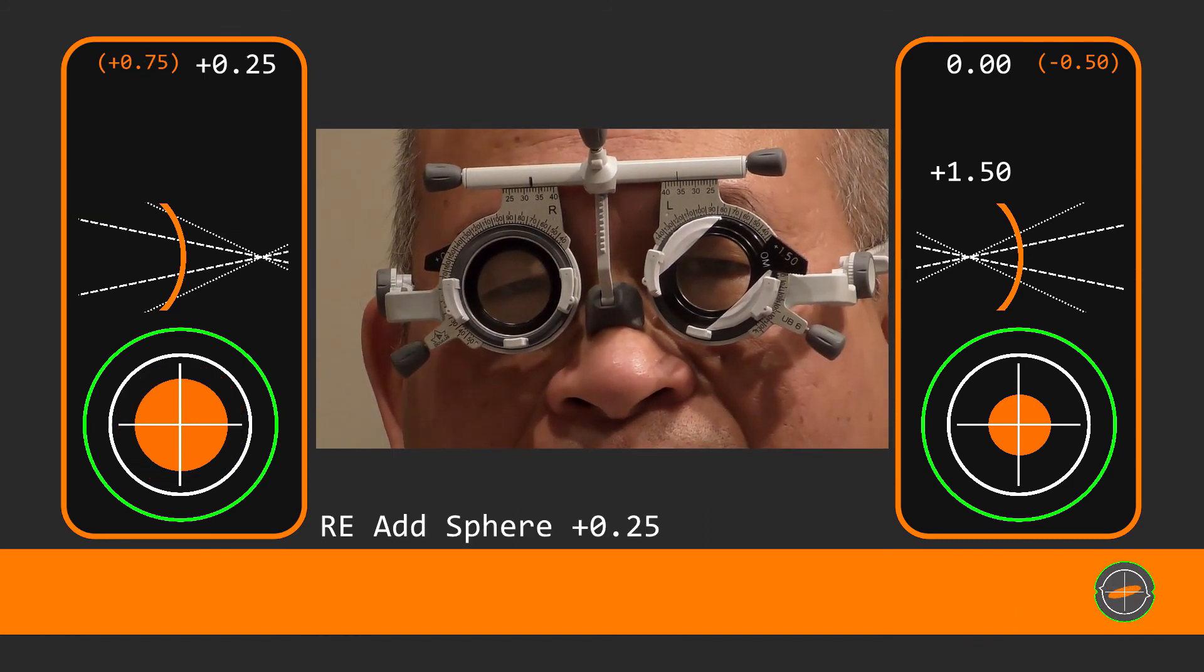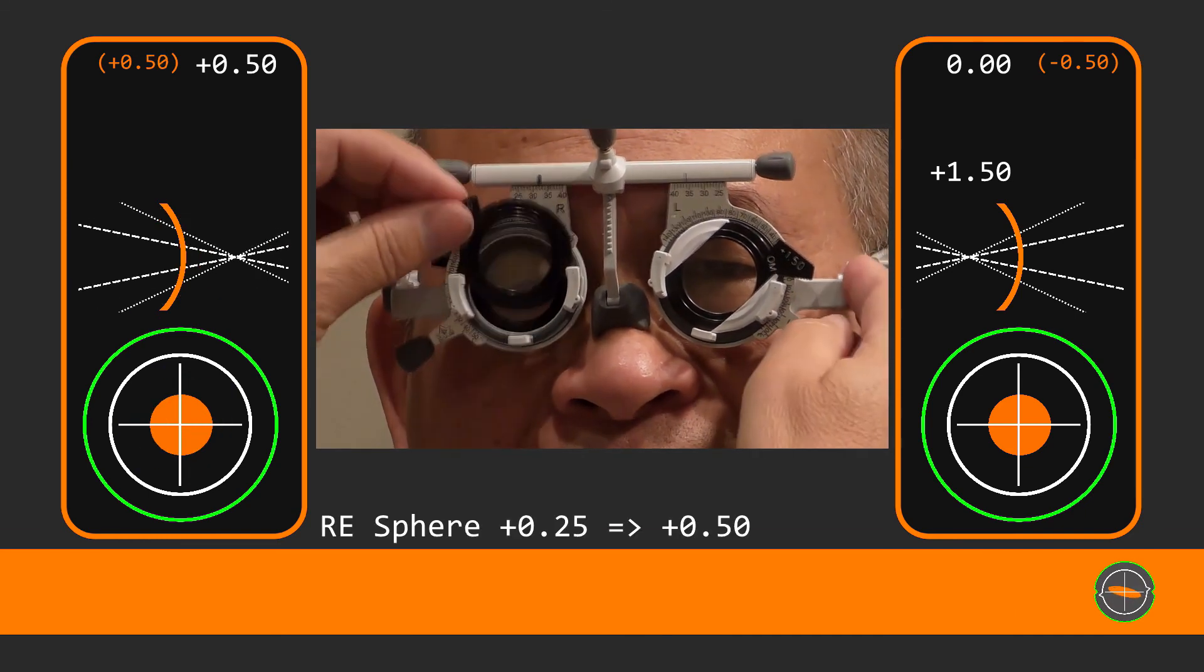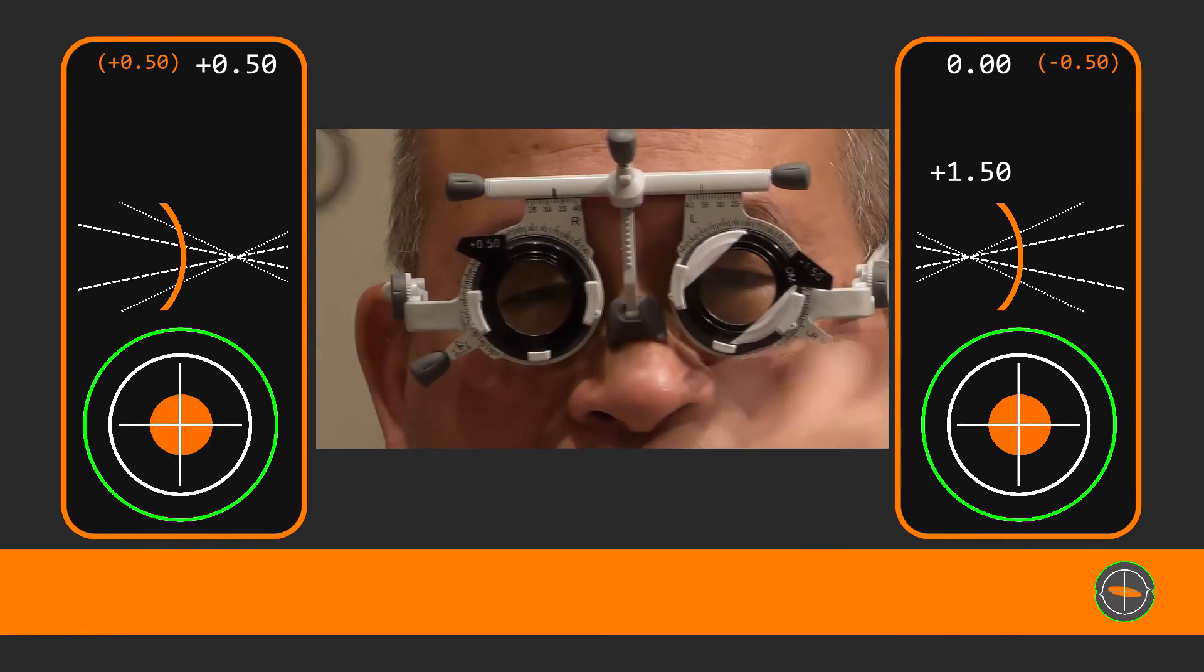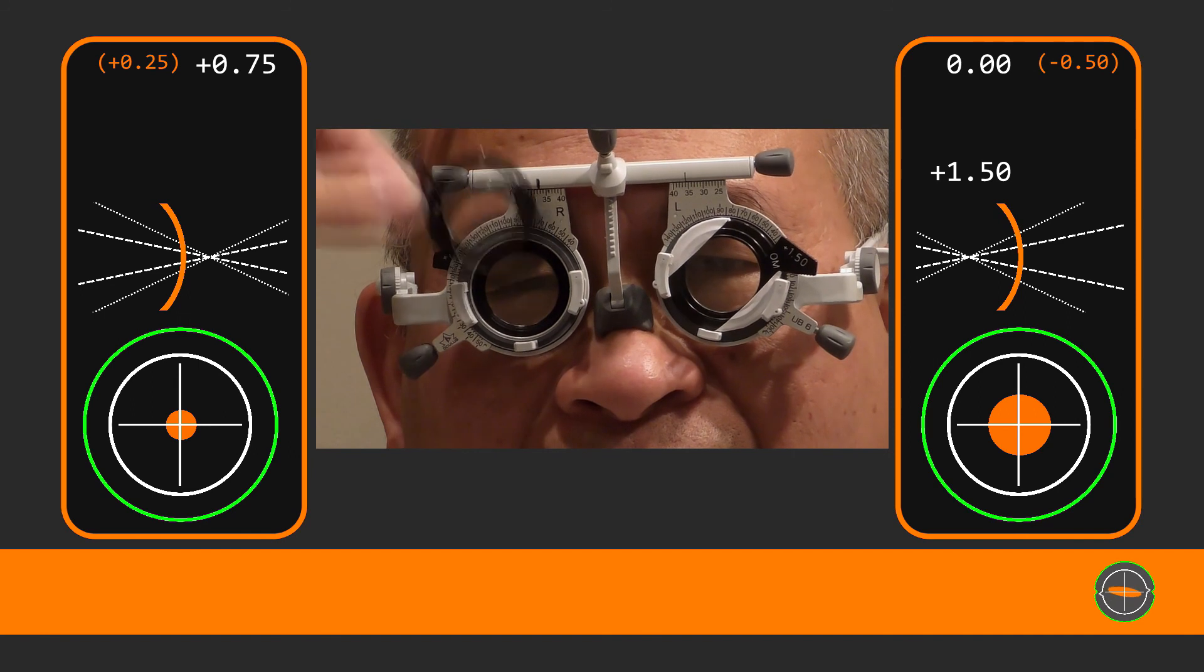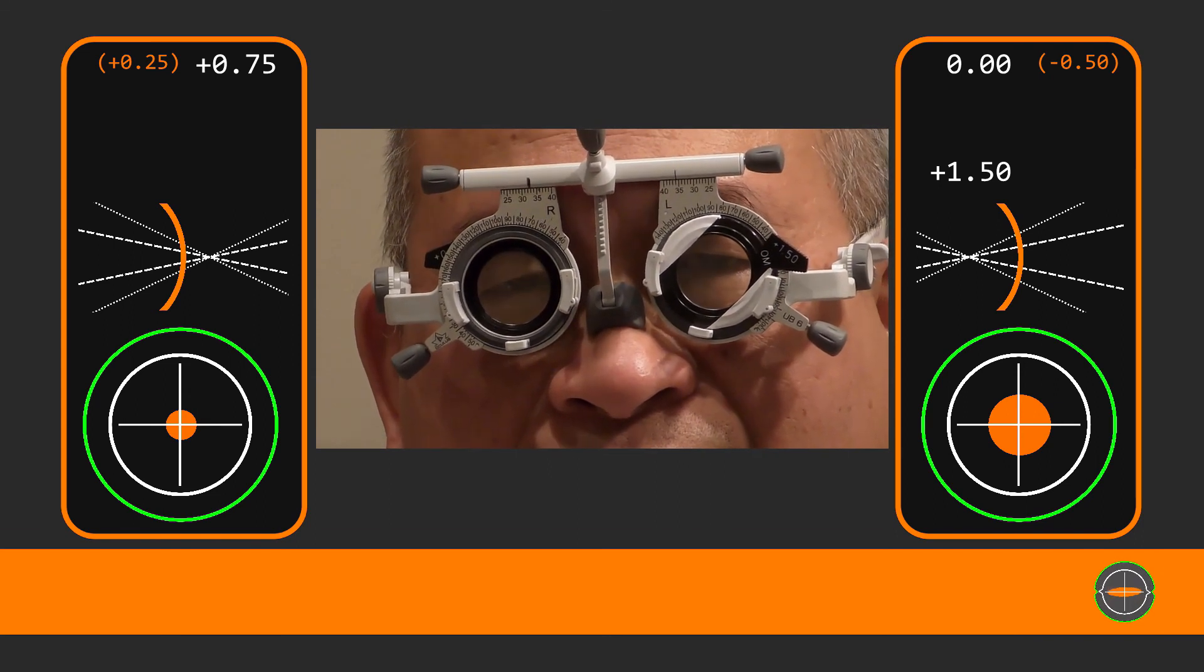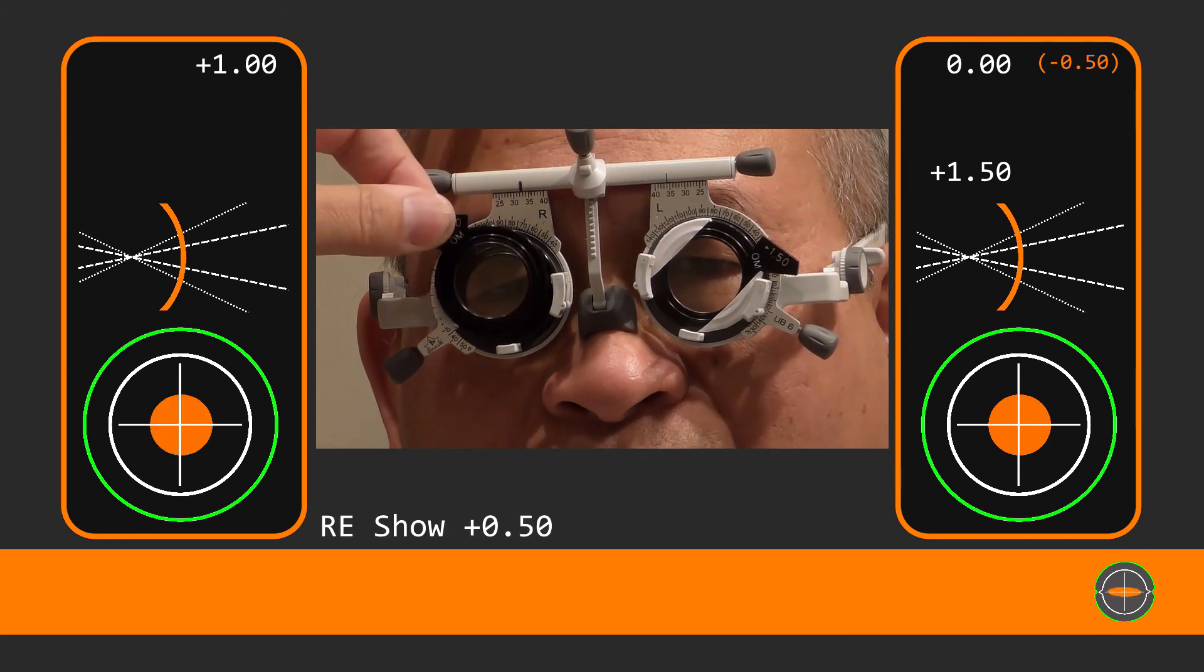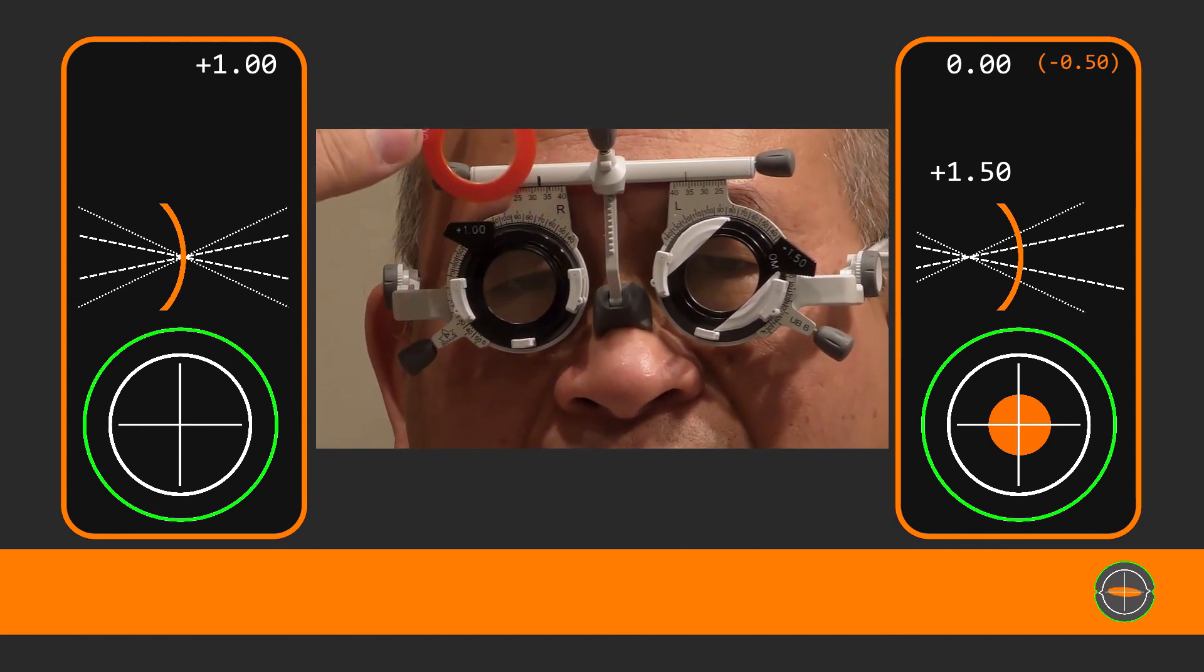Good shuffling. And better with this one or without? With. That's good. Plus lenses are shuffled remember? And better with this one or without?